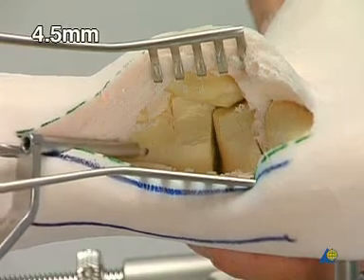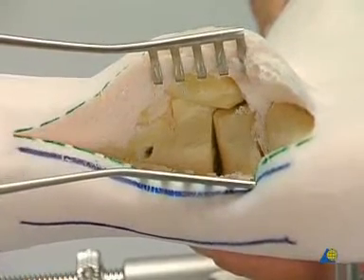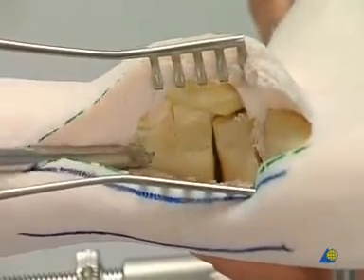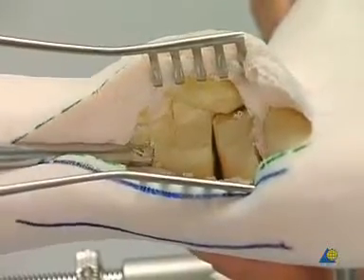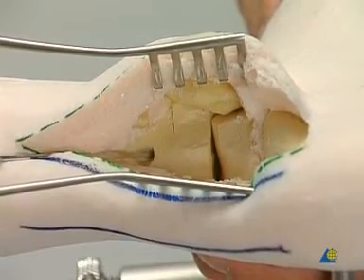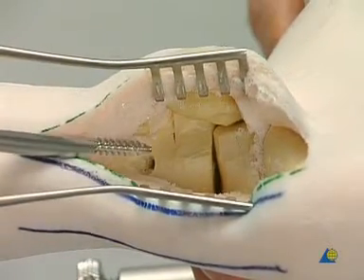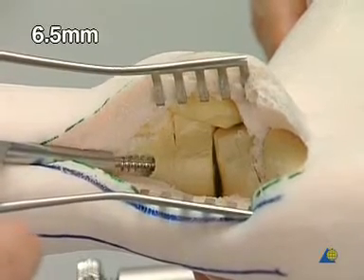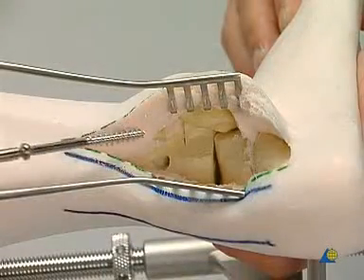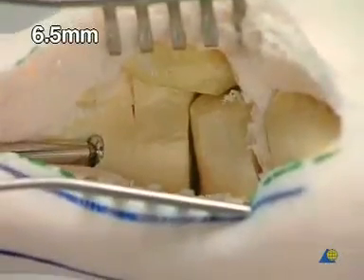The tibia is over-drilled with the 4.5 millimeter drill bit. Using the large countersink, a cavity is created to accommodate the screw head in an inclined position. The drill hole is measured. The 6.5 millimeter tap and corresponding sleeve are used for cutting the thread. A 70 to 75 millimeter long 6.5 millimeter cancellous bone screw with a 32 millimeter thread is inserted.